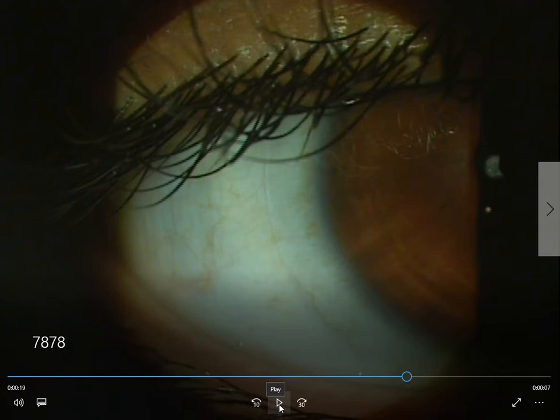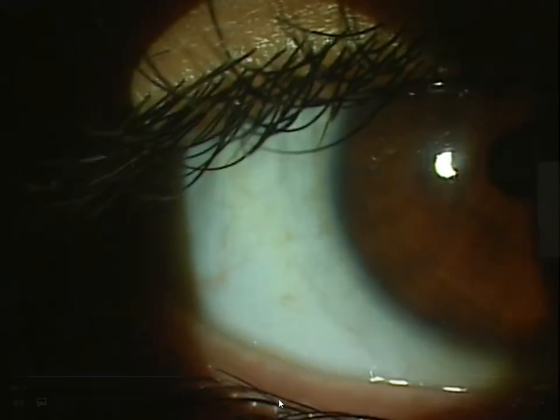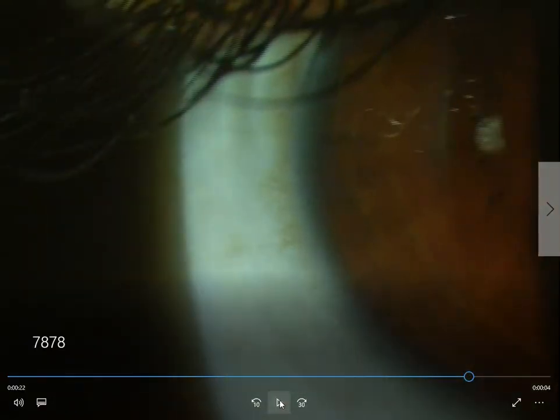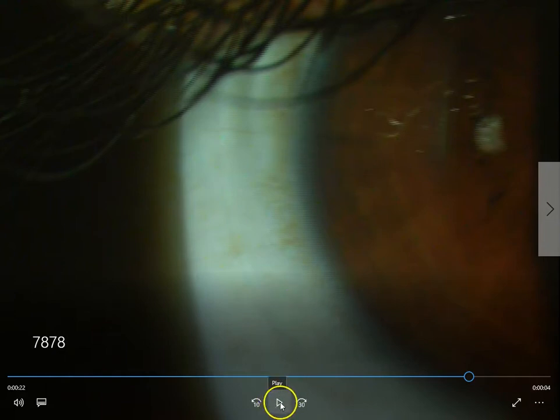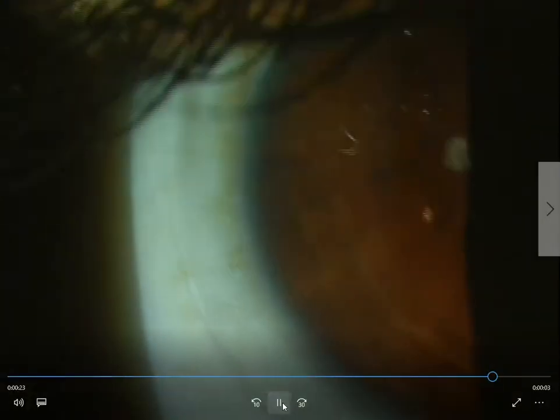In some contact lenses we have another marking in the eye that tells us exactly where the axis is. Sometimes this is done for manufacturing purposes — you can see the marking right there. Sometimes it's done as a way of evaluating the prescription in the contact lens. You can see that this lens is a 170 axis and you can see that it's oriented very nicely.